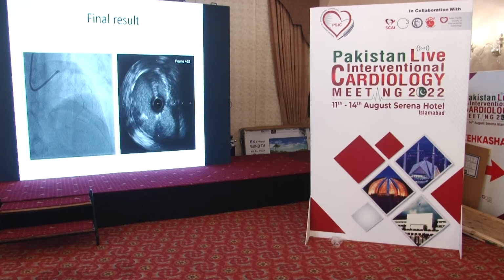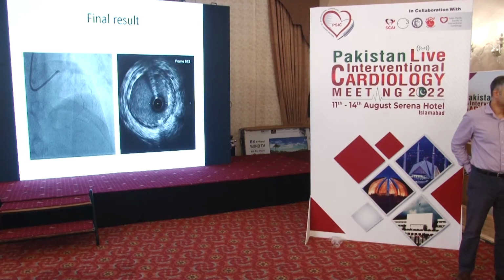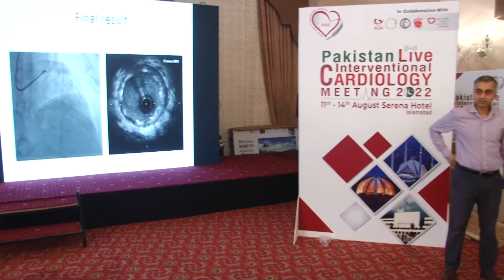So I think Sohail brings out a good point. You could have left it. And the reason is that the area that you calculate is also important. As long as you wouldn't leave it if it's malopposed, okay? But if you have a 5 by 5, so that's 25 at least, you know you have a really large lumen. And as long as you're well opposed, you could leave it. There's nothing wrong in that. As long as you understand that you've undersized it to the vessel, at 5 millimeters, you're not going to start getting restenosis significantly. In smaller vessels, a different story, right?